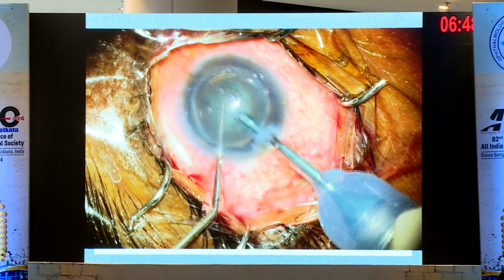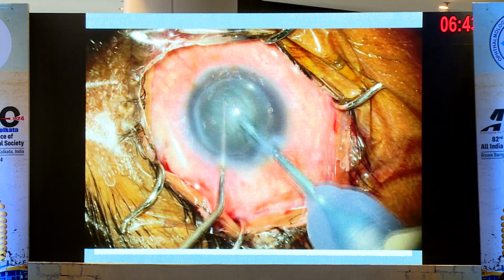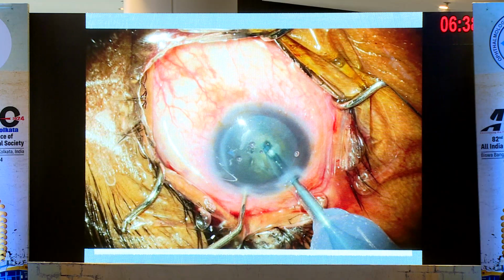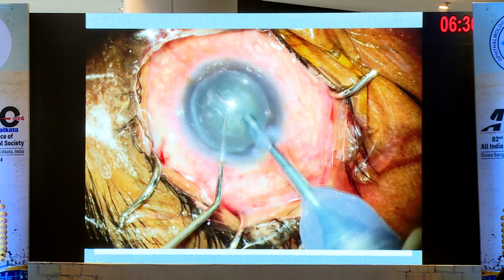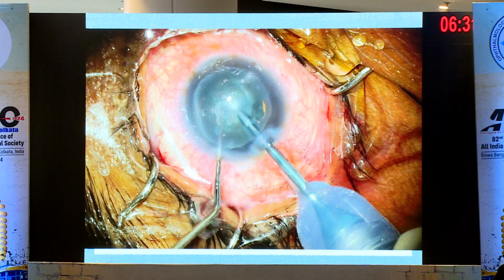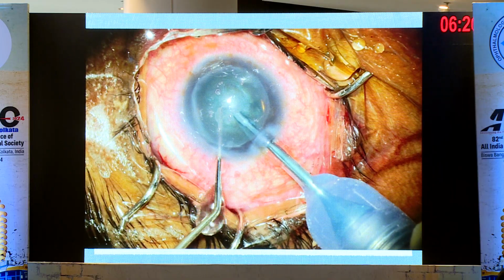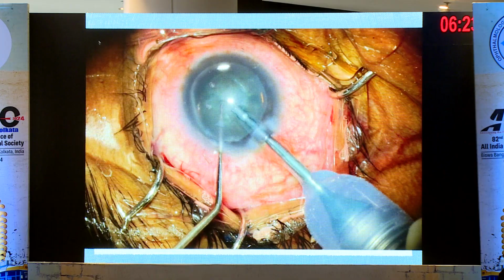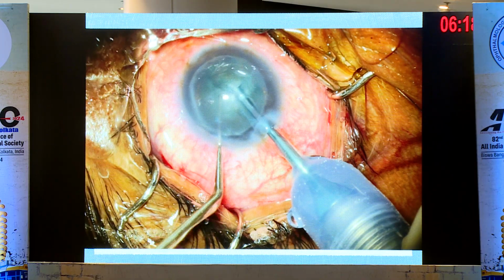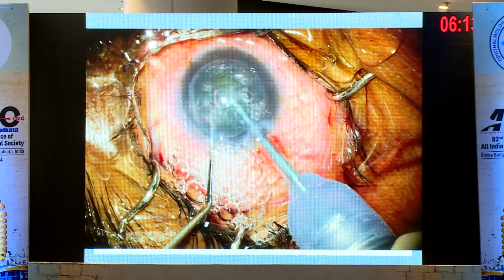The rest of the steps of phacoemulsification are routine, except that again you want to approach this like a case with a precious endothelium, because it is precious endothelium. You have an endothelial graft there, and we know that even if the graft is clear over time, most of these corneas do lose a lot of cells, and sometimes you may have a clear graft with as low as 500 or 600 cell count. So just try to do an in-the-bag, slow motion phacoemulsification, with repeated injections of OVD.